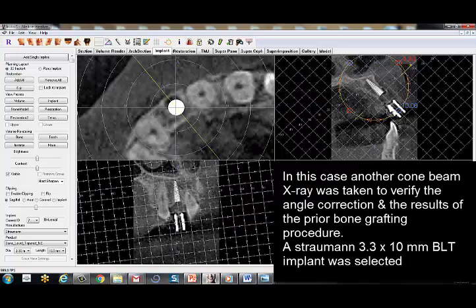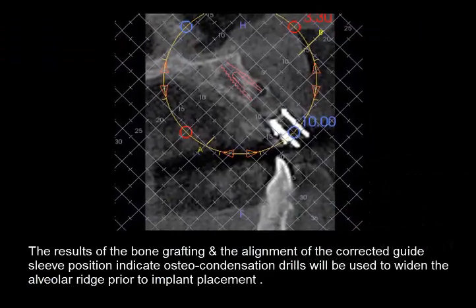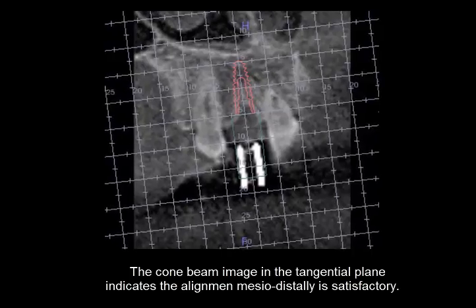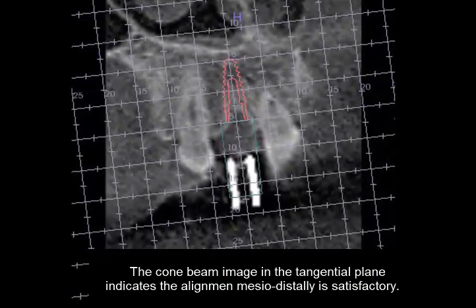6 months later, a second cone beam x-ray was taken to verify the results of the grafting. A 3.3 by 10 millimeter implant is selected for placement. The results of the bone grafting and the alignment of the corrected guide sleeve position indicate osteocondensation drills will be used during the surgical procedure. The cone beam image in the tangential plane indicates the alignment mesial-distally is satisfactory.